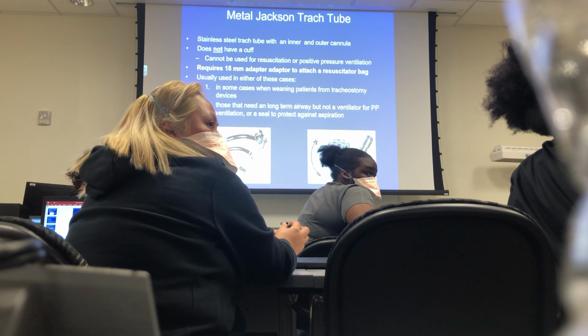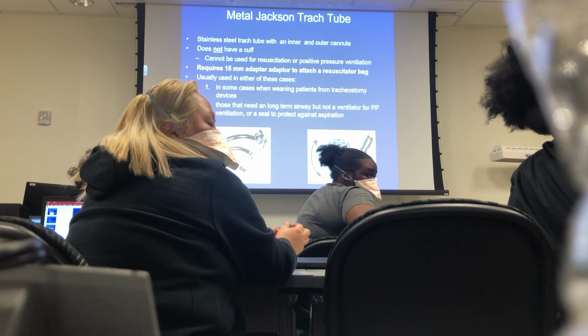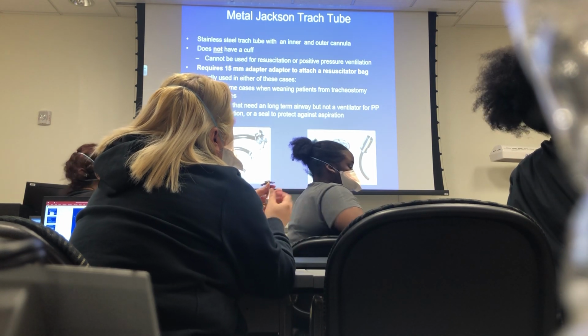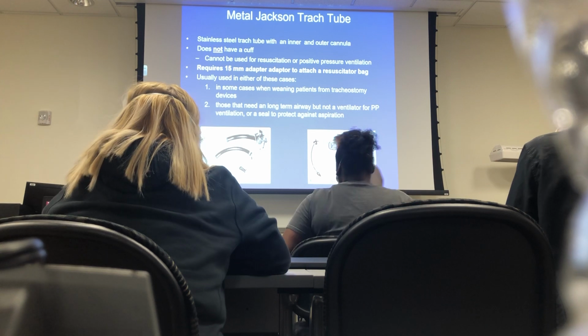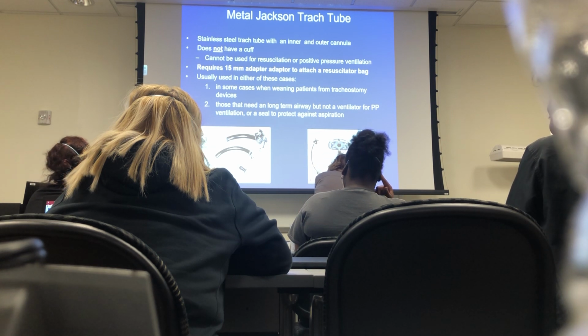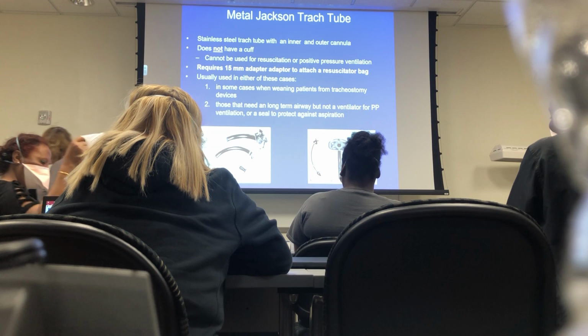You put this in, clean out the inner cannula, rinse with sterile water, and then you put the inner cannula back in the patient, okay? All right, so that's a metal trach. The metal trachs have 3 parts, just like all the other trachs: obturator, inner cannula, and an outer cannula. There's no cuff, they're cuffless.